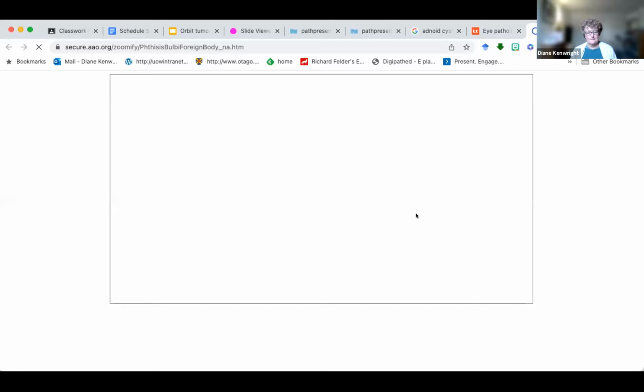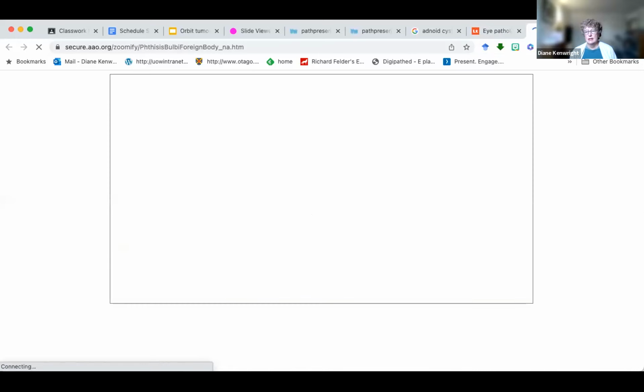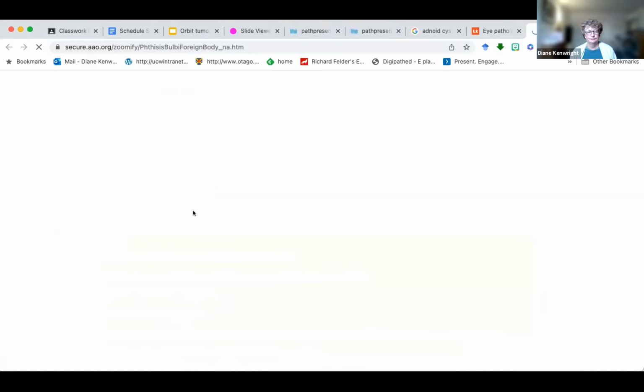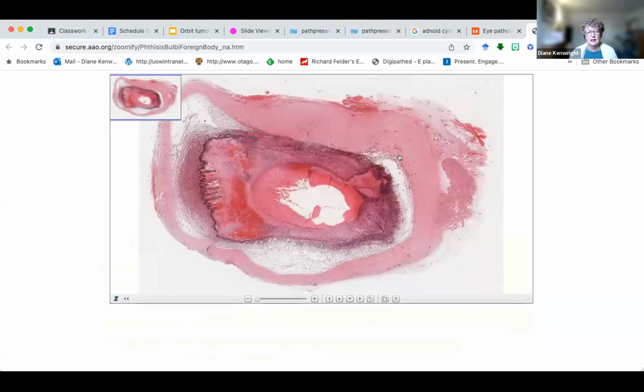I've just gone to LT here and clicked on here to get to the virtual slide, and the AAO is being a bit difficult at the moment. Sometimes if you try again, it goes faster. It says hopefully. There we go. All right, phthisical eye.